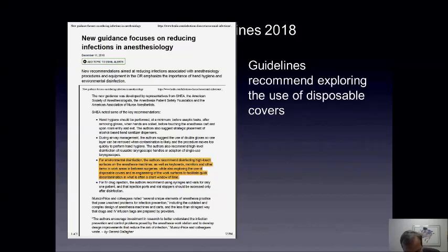Correct. Yes, and with regards to that, there is one of the studies that shows that, the first case of the day, they started culturing the anesthesia work surface, and after subsequent cases, the CFU or the bioburden on the anesthesia work environment progressively increased. That is, after the last case of the day, the CFU of the pathogen or the organism was significantly higher than the first case. So yes, if the machine continues to get dirty, at the end of the day, the organism from the machine can go to the next patient. So yes, in a way, we are protecting the machine so the subsequent patients don't get the infection.